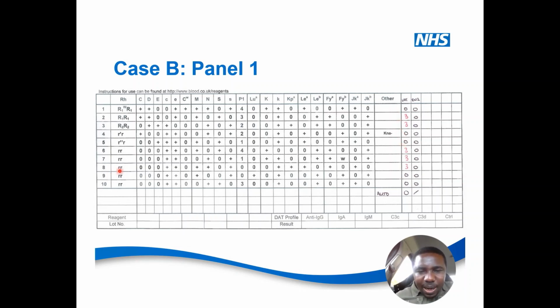Cell number 8 is positive, so you cannot cancel KPA. See it now. KPA is positive on cell number 8. The patient is also positive on cell number 8. Therefore, using the cancellation method, we cannot exclude KPA. We cannot exclude KPA, so we are suspecting it might be KPA, even though it did not match the reaction pattern. So KPA is suspected.